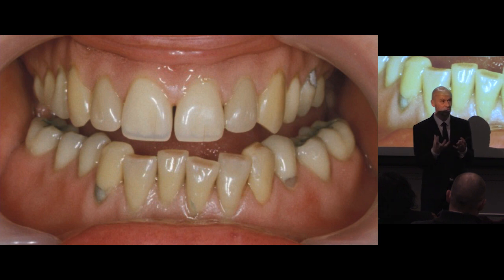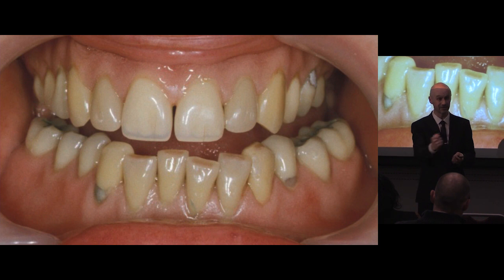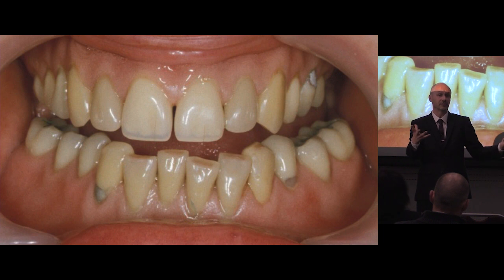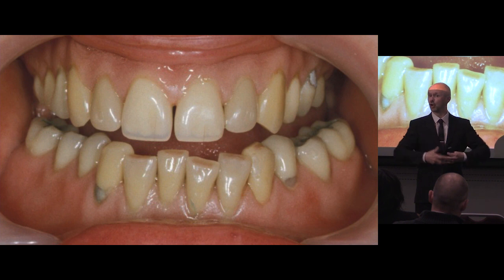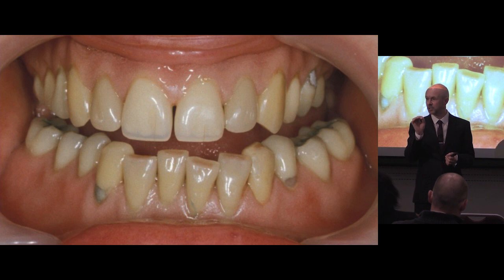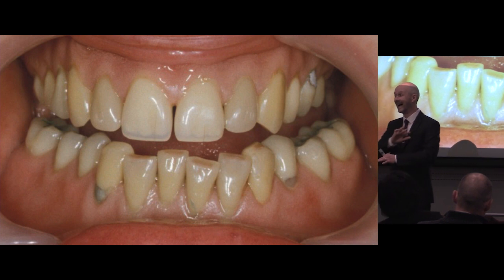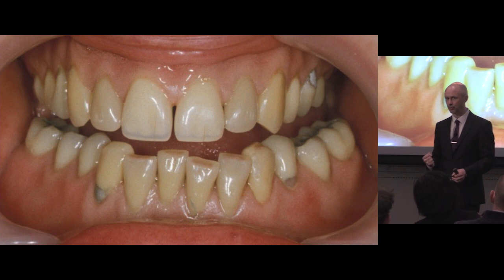Push it in, and if you've got enough undercuts in, it'll stay in, just like a filling in a tooth. As dentists put an amalgam in, for instance, that doesn't glue to the tooth, you've got to put undercuts in to stop it falling out. It's no different with these. We have no issues with the staining coming off or coming out. We've been doing it for almost 10 years now. Sometimes we do see a little bit of fading of the composite, but none of the patients complain about that at all, promise. So don't worry about doing it. Get that undercut in.